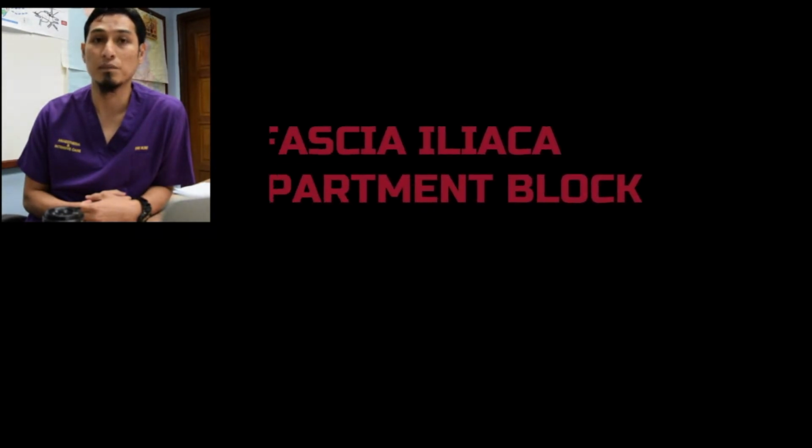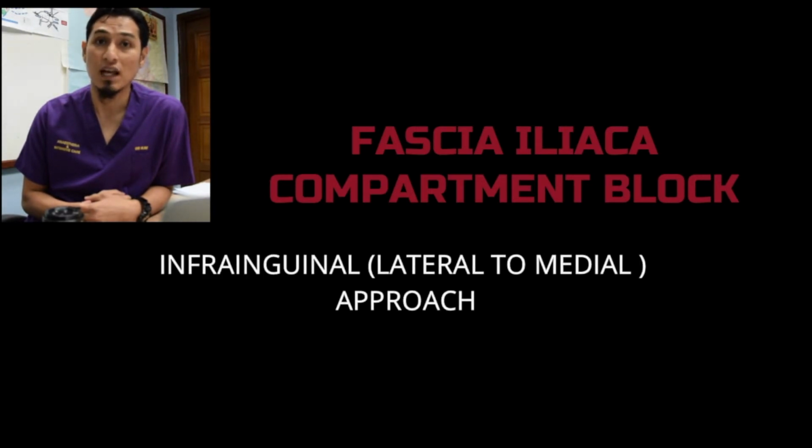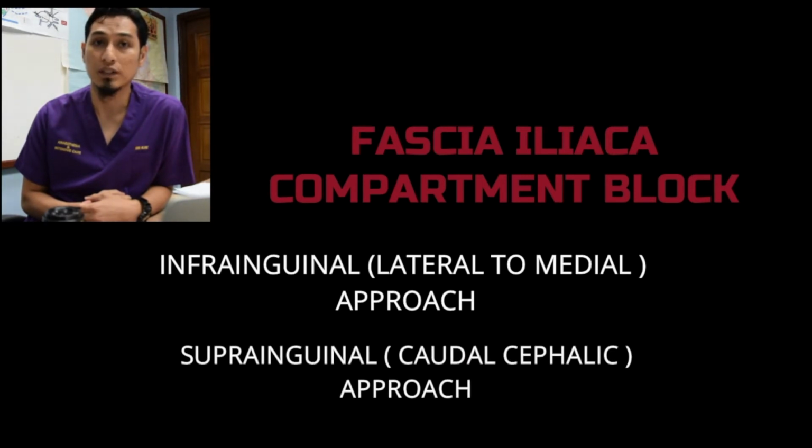In this video, we will show you how to perform fascia iliaca compartment block as an analgesic modality for hip trauma. There are two approaches for this block. The first one is infrainguinal, lateral to medial approach, and the second one is suprainguinal, caudal-cranial approach. In this video, we will show you suprainguinal approach with direct longitudinal axis technique.